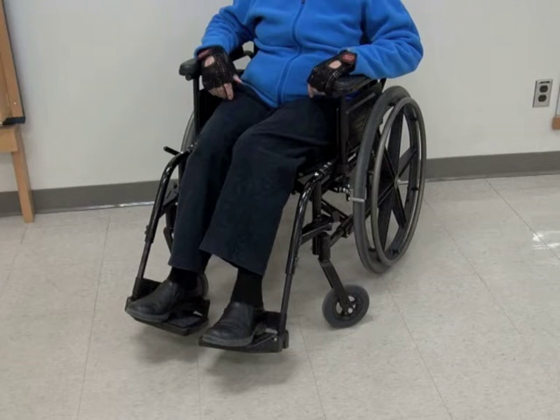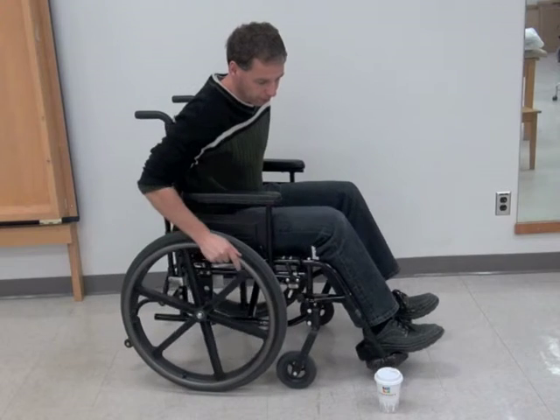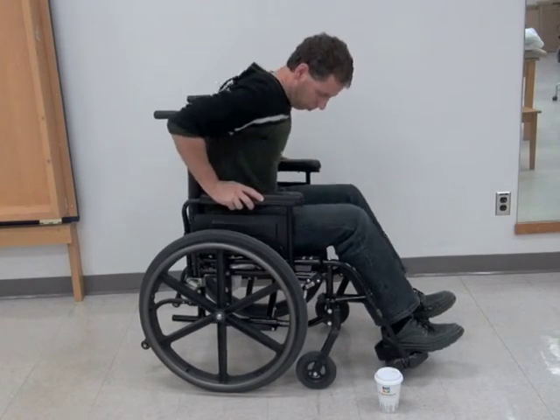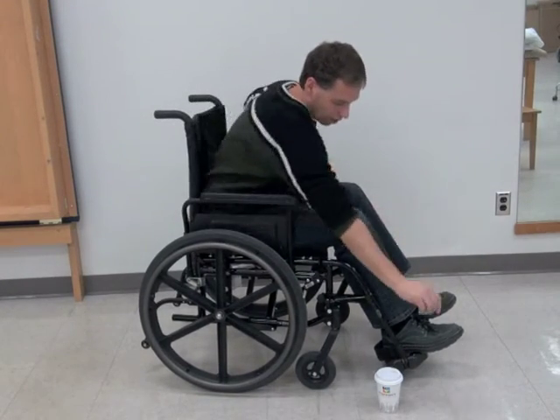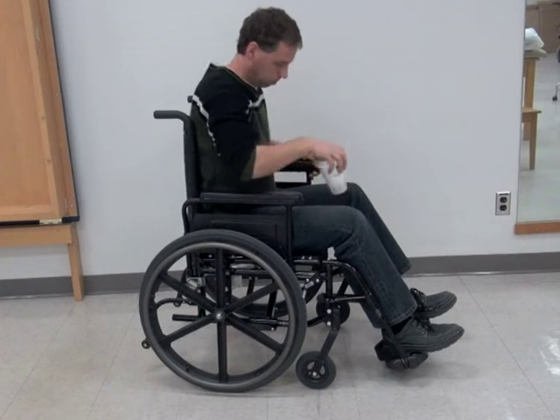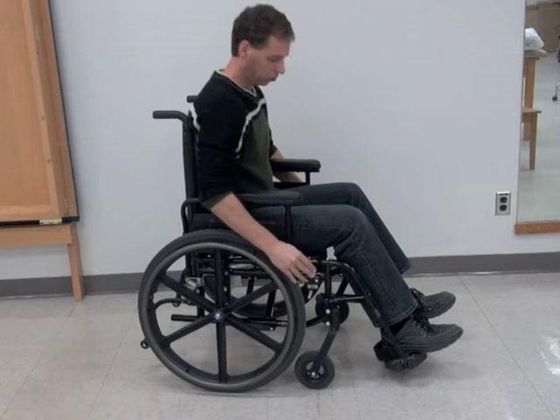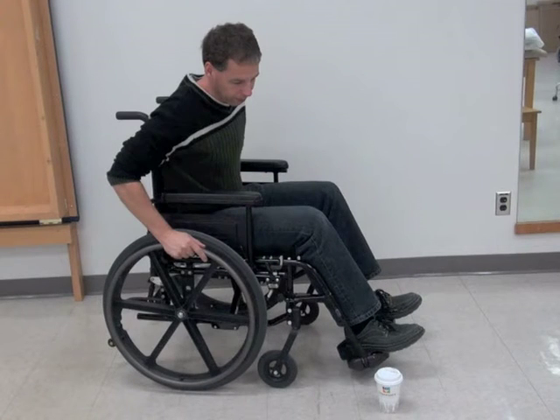You can potentially slide or fall forwards out of the wheelchair or become lightheaded if you lean too far too quickly. To reduce this risk, try to keep your bum as far back in the wheelchair as you can and lean forward with your trunk and hips. Don't slide your bum to the edge of the wheelchair if you are going to lean forwards. Never reach further than you feel comfortable or to the point where you feel lightheaded.